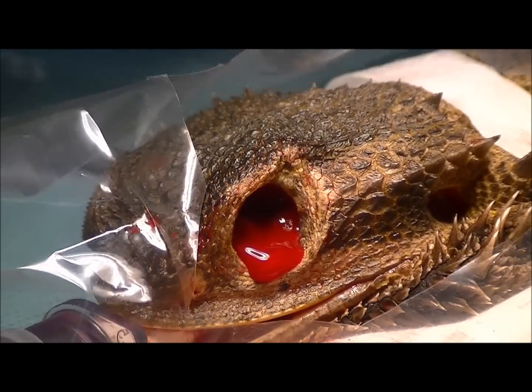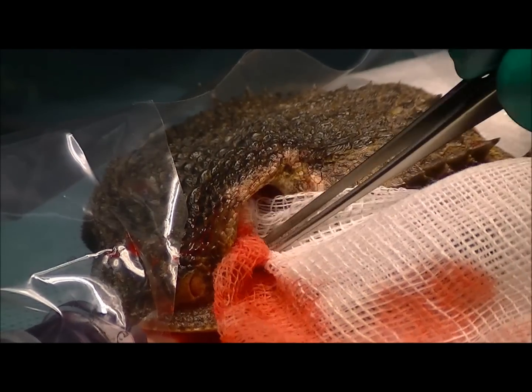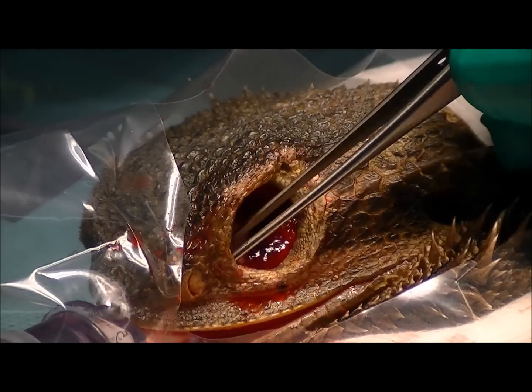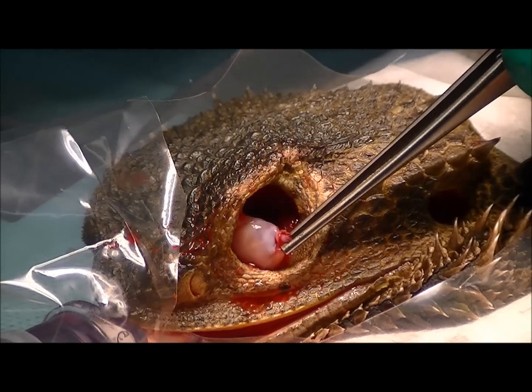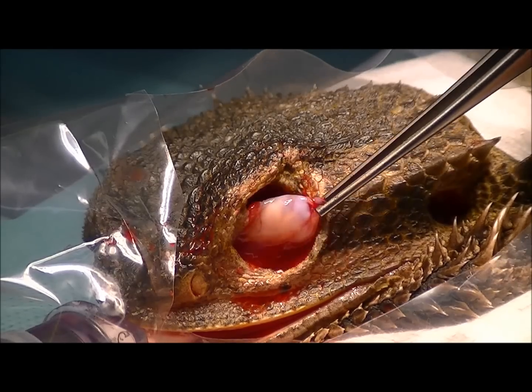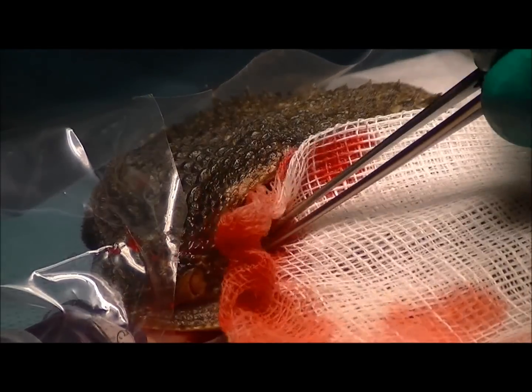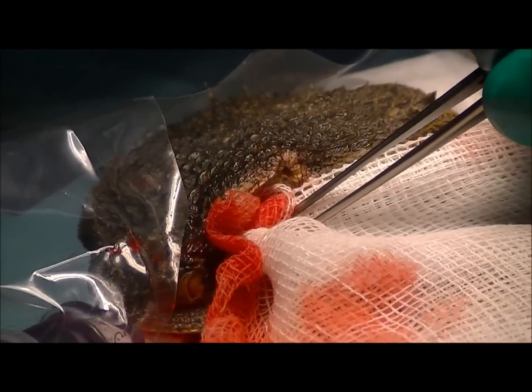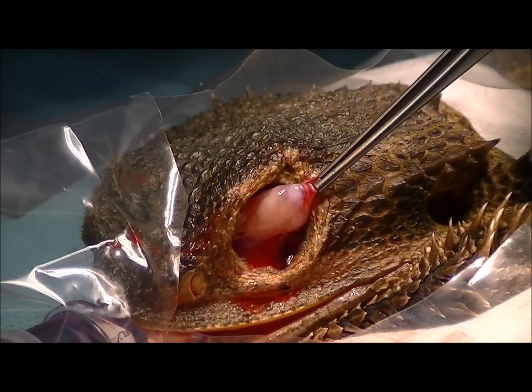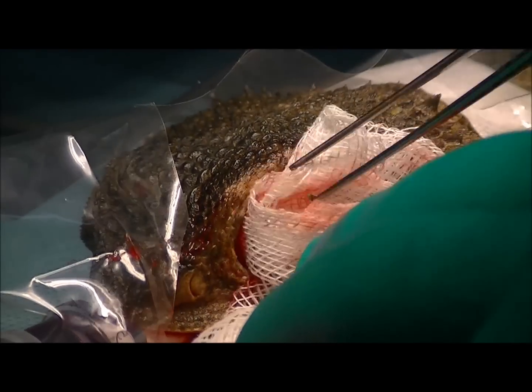In removing the eye we've actually been able to keep what's called the third eyelid intact — that's this little piece of pink tissue just here. What we're going to do is stitch this across that eye socket to create a framework for scarring to occur. It just minimises post-operative bleeding, chances of post-op infection, and looks a lot better than having a big hole across the head.